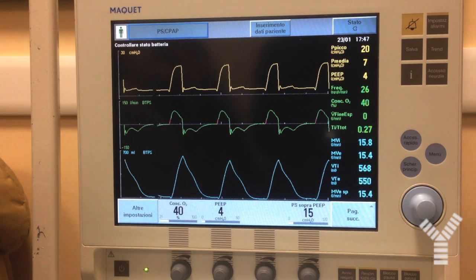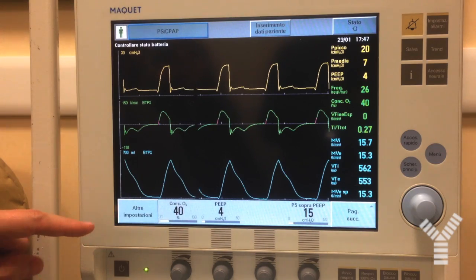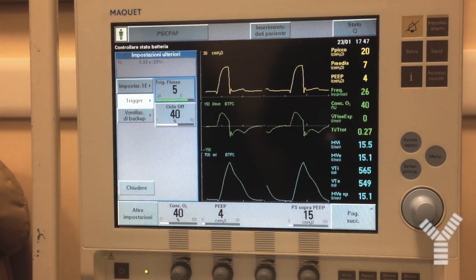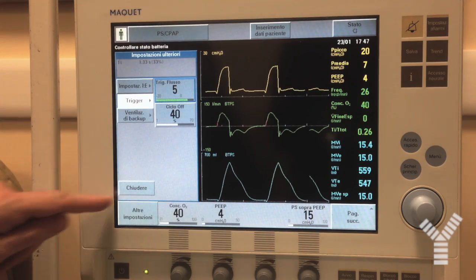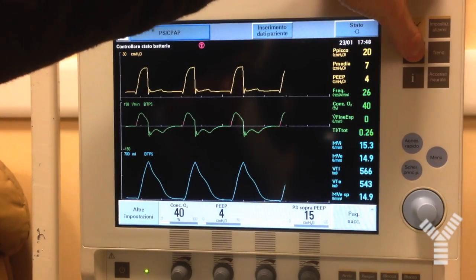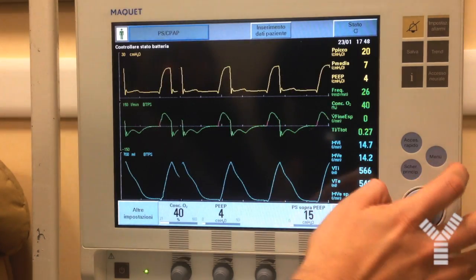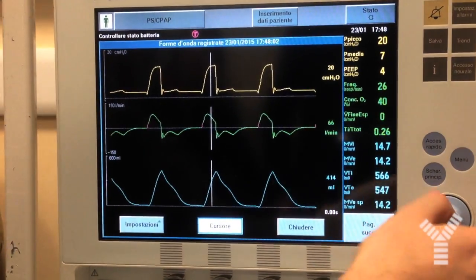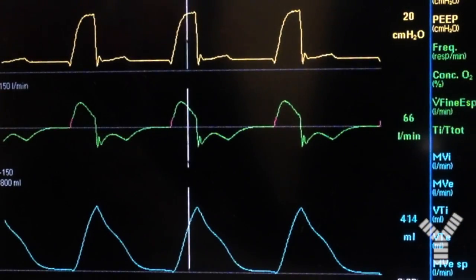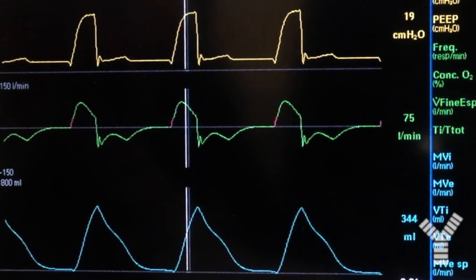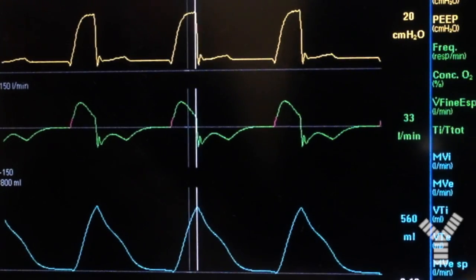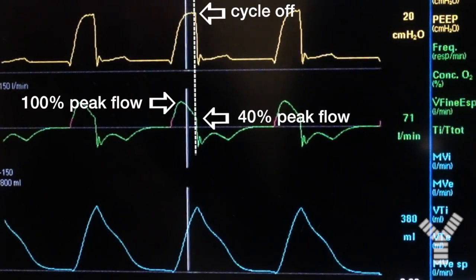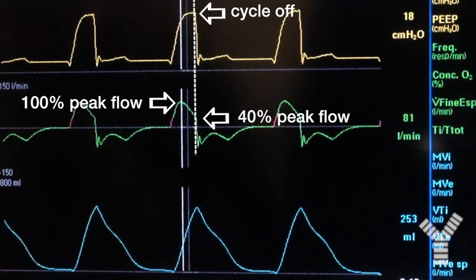In this video we will understand the meaning of the expiratory trigger of pressure support, which in this case is set at 40%. We go back to the SAVE waveform, and the expiratory trigger is set at 40%. This means that the pressure support will cycle to expiration when the flow is 40% of the peak inspiratory flow.